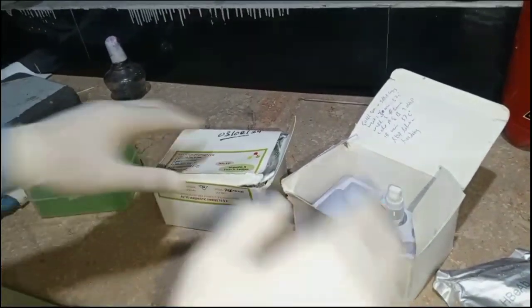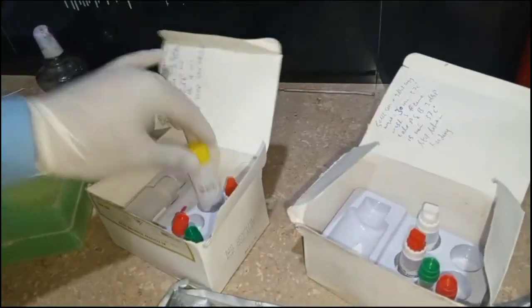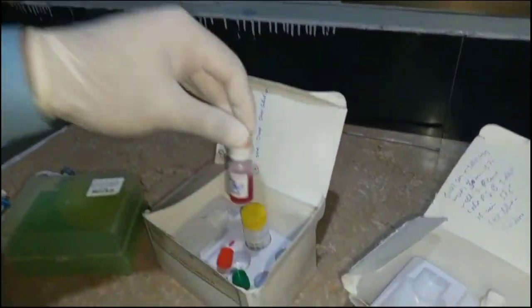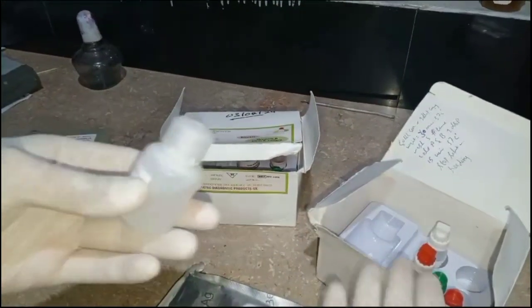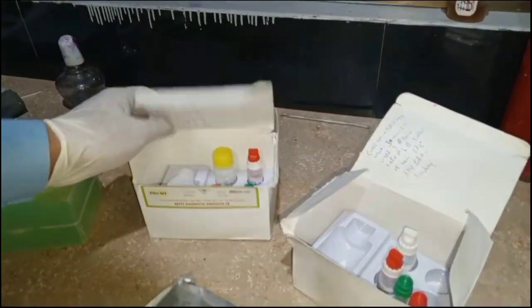The same things are also present in the HBeAg kit. It also contains wells, as you can see. These are the wells that are coated with the antibody, so when antigen is present, it will react. So these are the HBeAg wells. We need a stop solution. This is the HBeAg conjugate, and it also contains the positive as well as negative control. It also contains the wash buffer as well. So wash buffer is present in the case of both HBeAg and HBeAb.